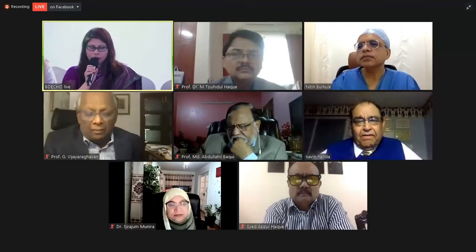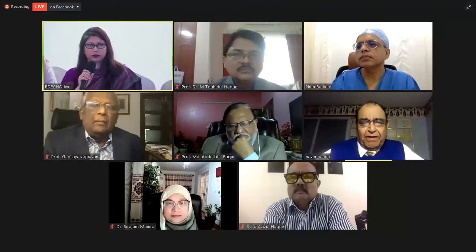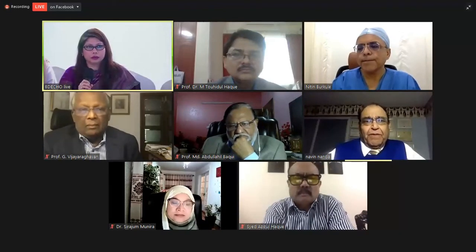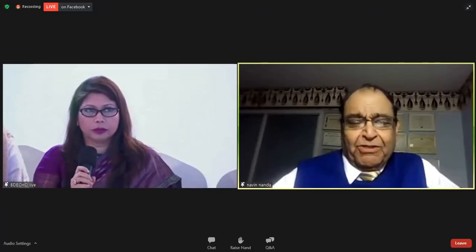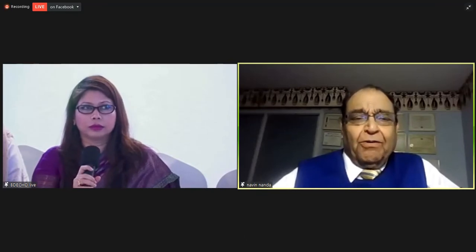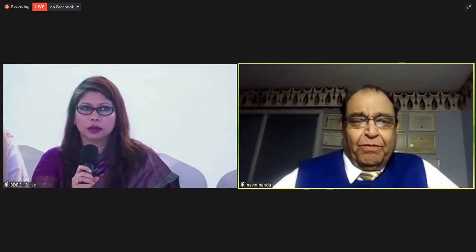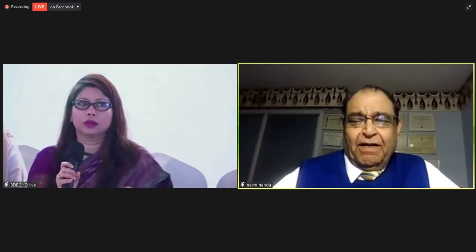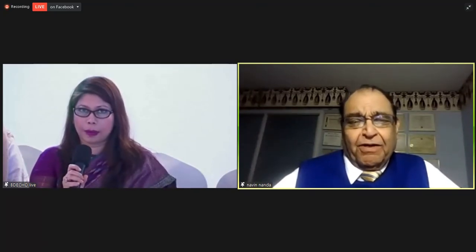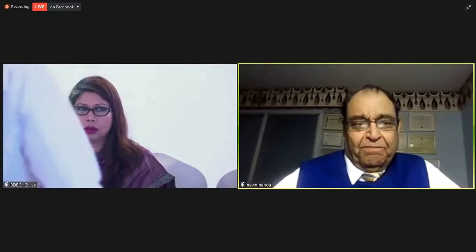Any role? I don't think there is any very good literature on that so far as speckle tracking is concerned. But remember one thing about 2D speckle tracking, it depends quite a bit on the window. If the window is poor, like many of the COVID patients have poor windows, you may not get good results. So, with all the hype that we have with speckle tracking echocardiography, you have to remember that one of the major problems is the window problem. If you don't have a good endocardial definition, like we don't have many times, unless you do contrast echocardiography, then speckle tracking echocardiography results may not really be very accurate. So in COVID patients, that could be a problem in some of them.